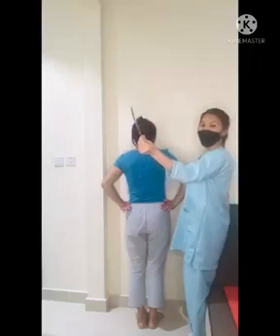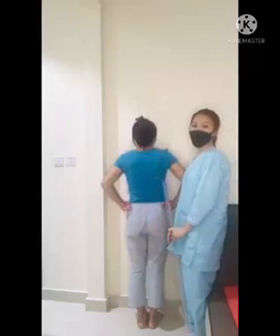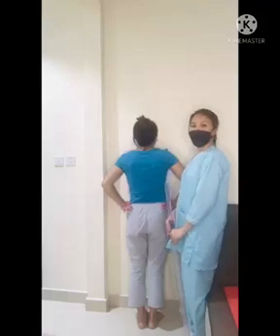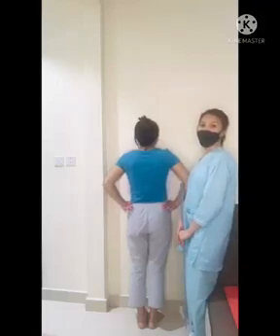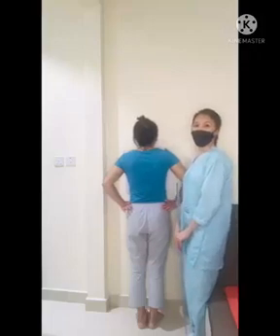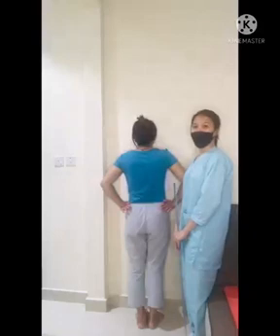We instruct the patient to suspend at full inspiration to depress the diaphragm as much as possible. The structures shown in this projection are the rib cage and scapula.